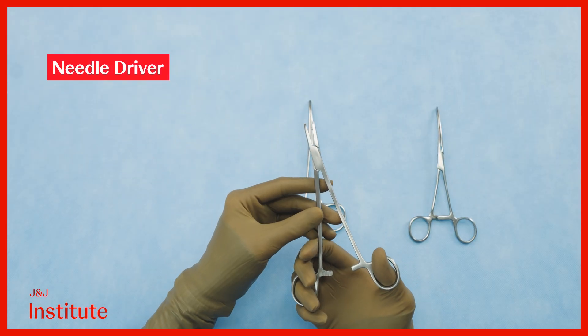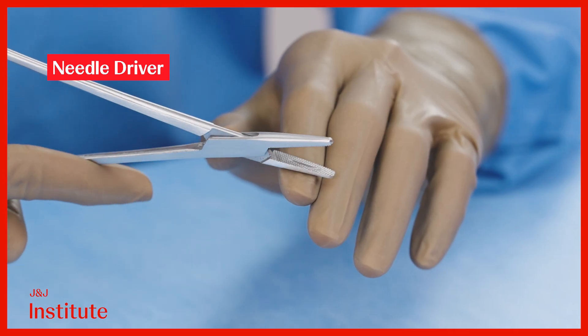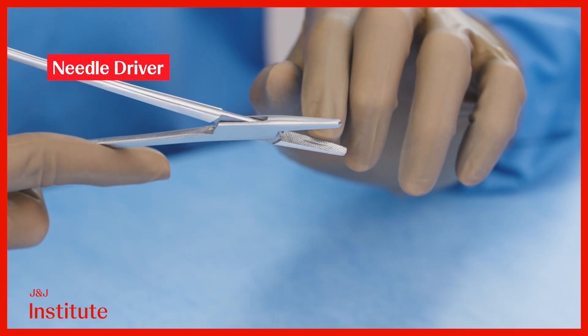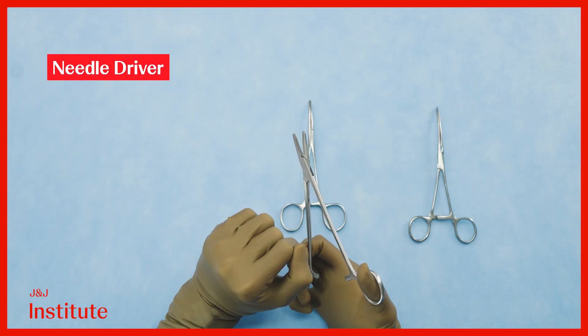A needle driver has a tough and short jaw which is milled with a diamond pattern for grip. It also possesses a longitudinal groove that further improves its hold on the needle.